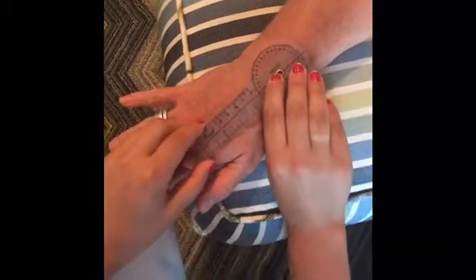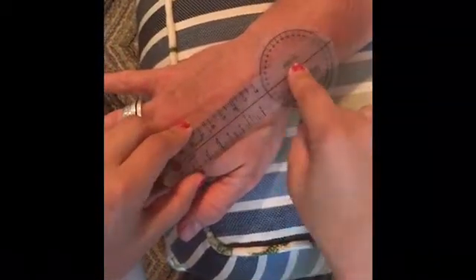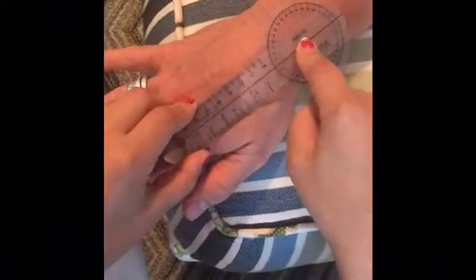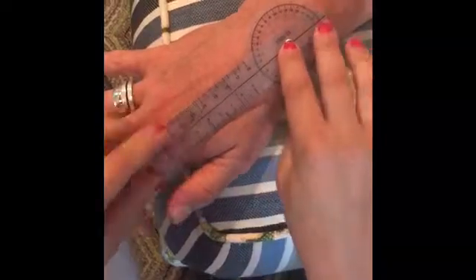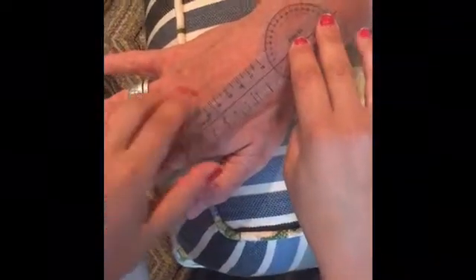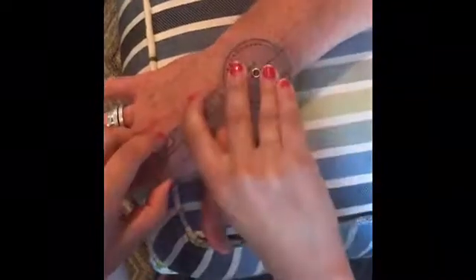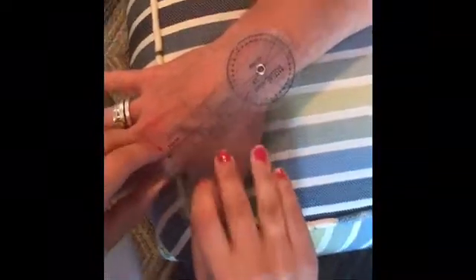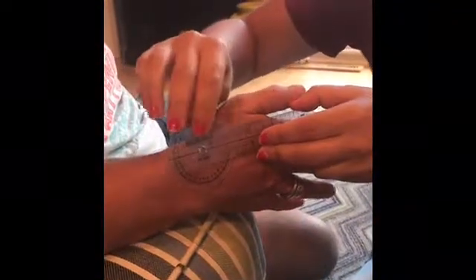We're going to be measuring the thumb CMC joint radial abduction, also known as extension. So the typical range of motion is 0 to 20 degrees. The axis is going to be over the CMC joint at the base of the thumb metacarpal. The stable arm is parallel to the second or index finger metacarpal, and the moving arm is parallel to the first or thumb metacarpal. So go ahead and abduct your thumb. It's at 30 degrees.